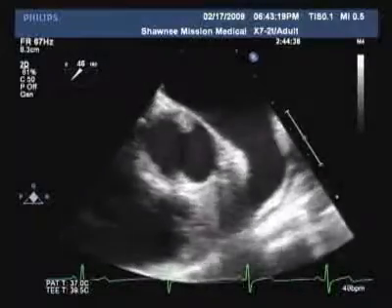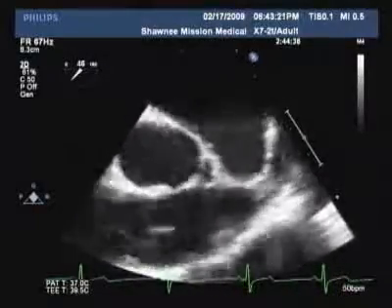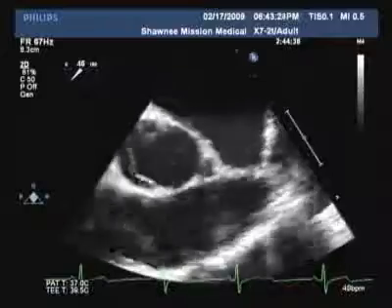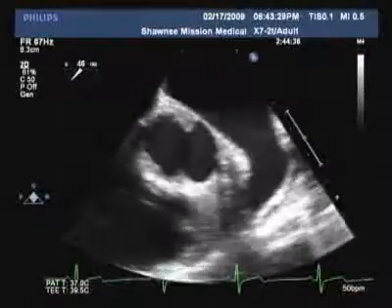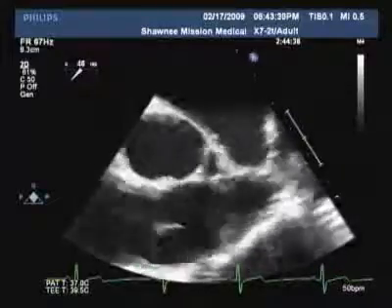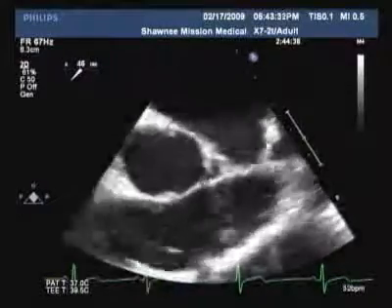And the problem with that is if you form a blood clot in there, the first place it's going to go if it gets dislodged is up to the brain, typically a stroke. Could also, though, go to the upper extremities or lower extremities. So a lot of times we use this procedure in patients who have atrial fibrillation. We may not know how long they've been in it.